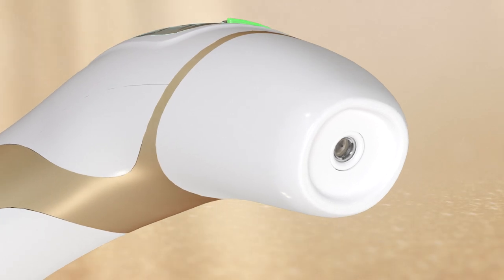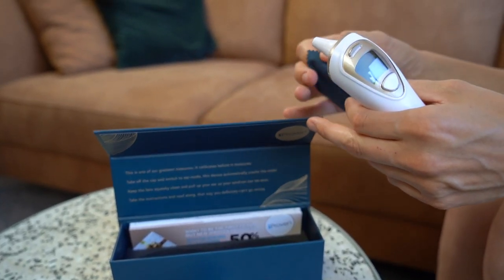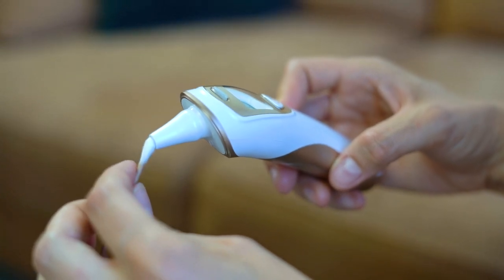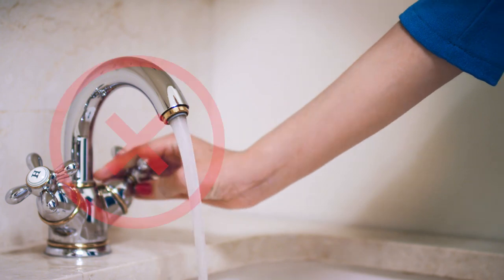It is important to clean your thermometer regularly. An obstructed lens will make your reading inaccurate. Take the microfiber cloth and wet it slightly. Using the cloth or a cotton swab, remove any dirt stuck to the edges of the lens. Don't use any abrasive cleaning products or immerse the device in liquid.